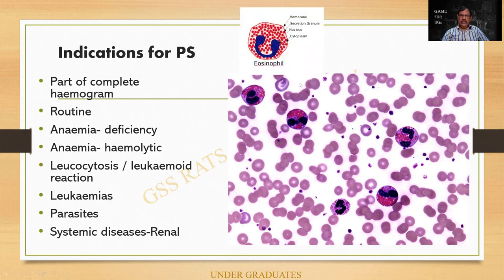I hope you people have made a diagnosis of this. It is an eosinophil — so many of them are there. We identify it not only by the bilobed nucleus, but also by the brick red granules. In fact, the more important identifying point will be the brick red granules.